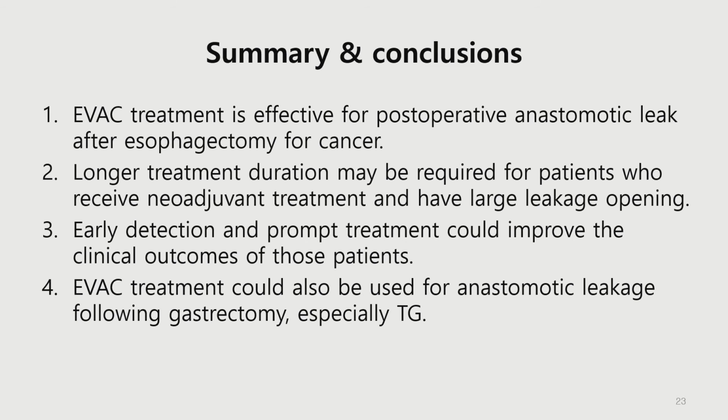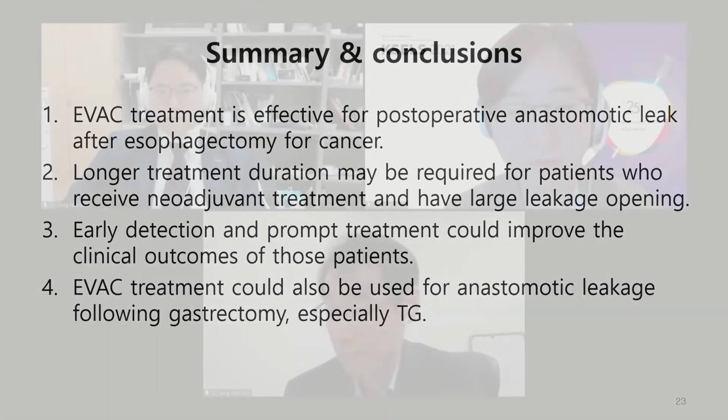Endoscopy vacuum treatment also could be used for anastomotic leakage following gastrectomy, especially total gastrectomy rather than subtotal gastrectomy. Thank you for your attention.